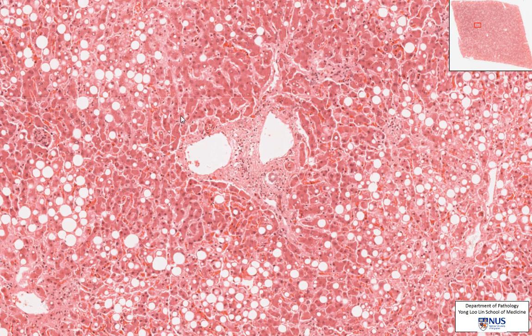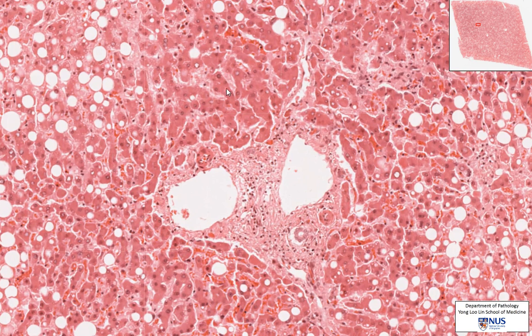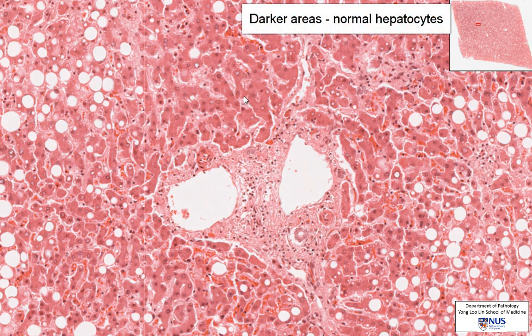Around this, there are actually quite normal trabeculae of hepatocytes. We can see that the cells are polygonal, they have quite dense granular pink cytoplasm, and relatively small rounded nuclei.